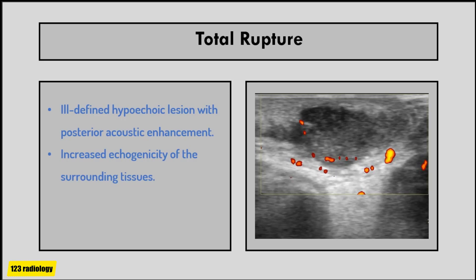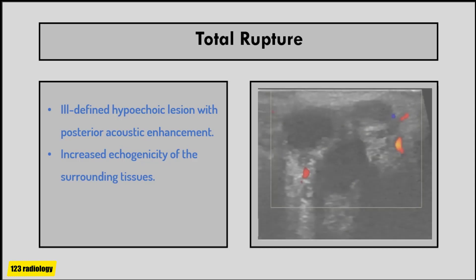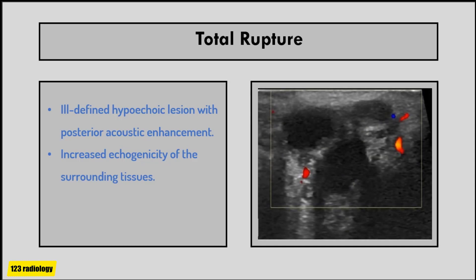A big change in the morphology of the cyst will happen if total rupture occurs. This will result in an ill-defined hypoechoic structure. Posterior acoustic enhancement is usually seen, and increased echogenicity of the surrounding tissues and peripheral vascularity may be noticed. In this case of epidermoid cyst with total rupture, there is an ill-defined hypoechoic lesion with dermal attachment and posterior acoustic enhancement, with color Doppler showing peripheral vascularity.